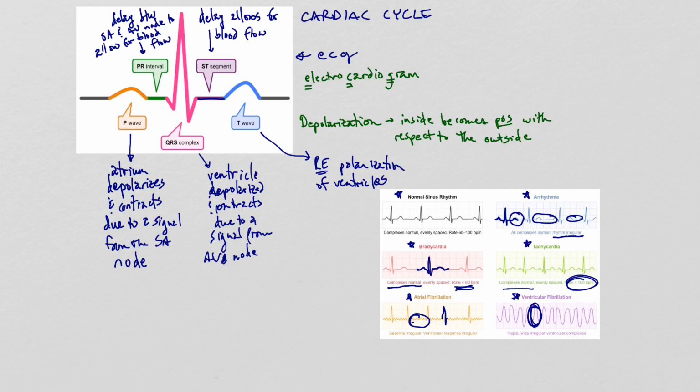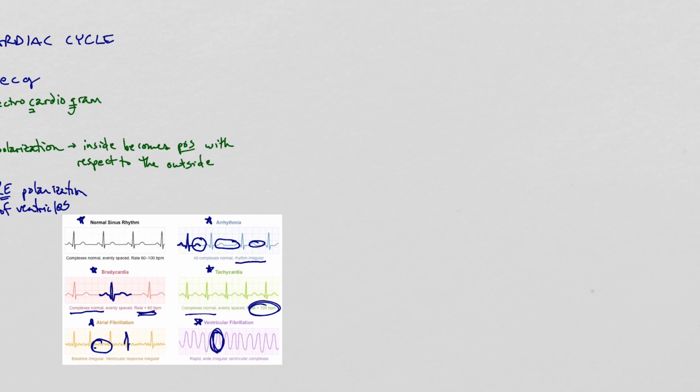As you know, if you have some problems with your heartbeat, you can get a pacemaker. And a pacemaker is a real interesting piece of equipment, in which, let's draw ourselves a little chest here. All right, so we're going to have our heart.